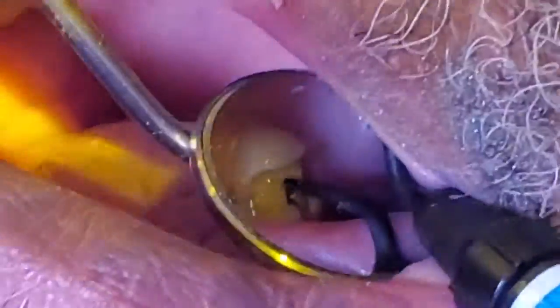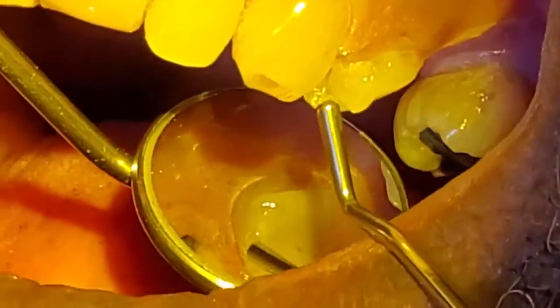The beautiful thing with this dentin replacement material is that not only does it flow magnificently, but it's kind of strange — it flows like vaseline almost, but it's a dental replacement composite. Notice it just sits there, and now I can take my plastic instrument and manipulate it any way I want, making sure my gingival margin is totally sealed, maneuvering around the buccal. You can see I can literally move it wherever I want to move it. I'm going to hit that with my curing light and then add a little more on the buccal just to fill in all my gaps.